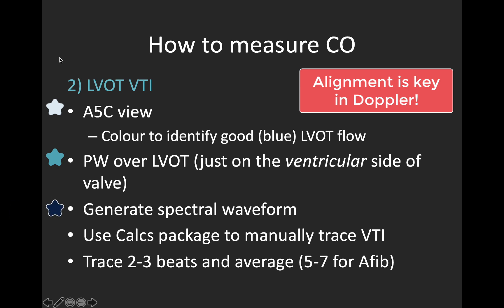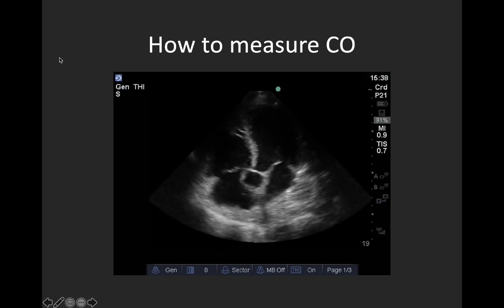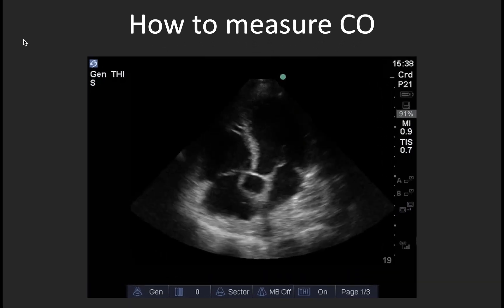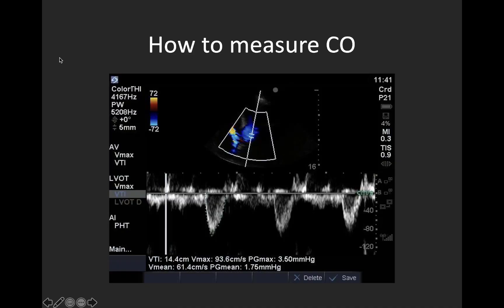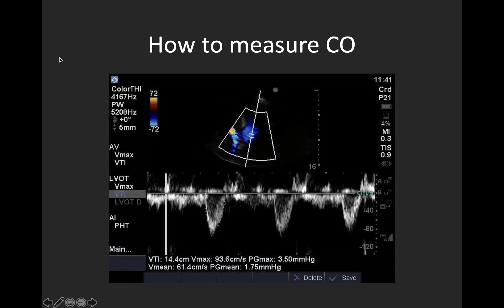Next, we generate a spectral waveform, freeze it, and then use the calcs package — which comes on almost all machines — to manually trace the velocity time integral. Your waveform should look like a bright outline with black inside; this is called the modal velocity, and we want to trace at the black-white interface. Ideally, trace two to three beats and average them for your best reading, and more if the patient is in atrial fibrillation. Here is an apical 5-chamber view nicely showing the LVOT. We place our PW gate within the LVOT, just on the ventricular side of the aortic valve. Colour was used here — we have a nice strong blue signal in the outflow tract. The PW gate should be between three and five millimetres generally. We've generated a nice clear VTI waveform that has been manually traced to get a VTI of 14.4 centimetres for this patient.